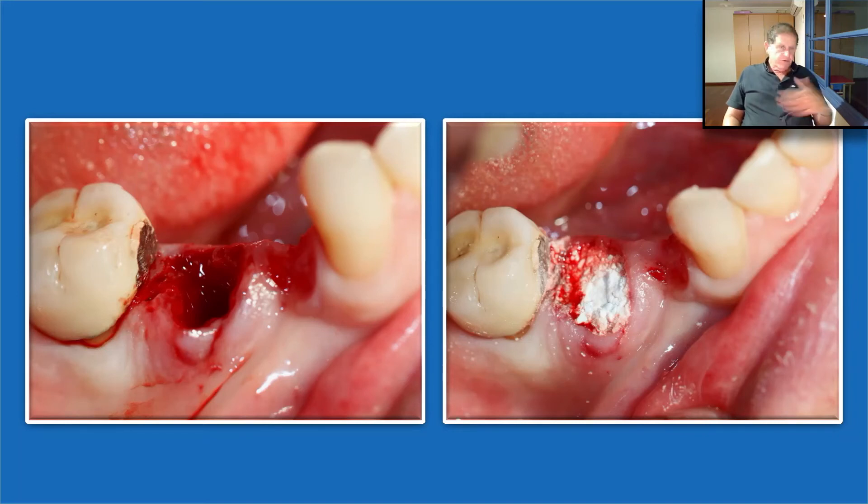If you don't have a buccal plate, you need to push the material down to fill the buccal plate defect. If you have a four-wall socket, you don't need to push it to the apex — just inject it, but it must be well condensed in the cervical zone. Place a dry gauze above it, press with a finger for three seconds, then take a periosteal elevator, add additional compaction for two to three seconds. Remove excess and protect it with the Oraid.